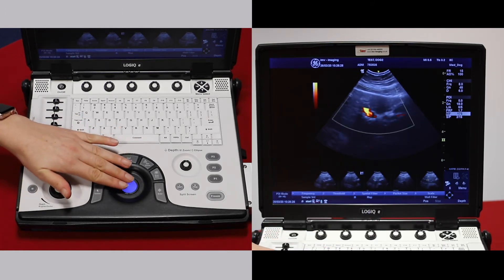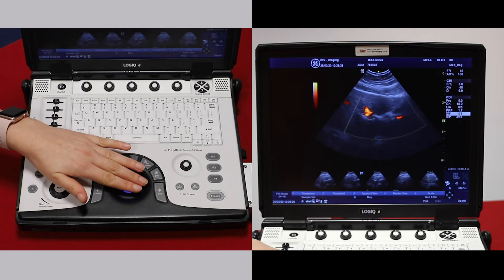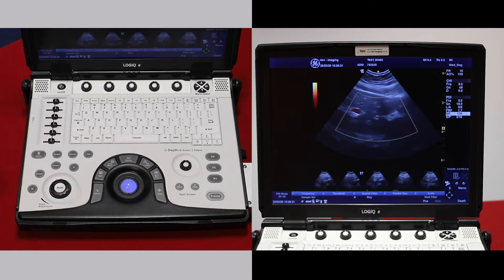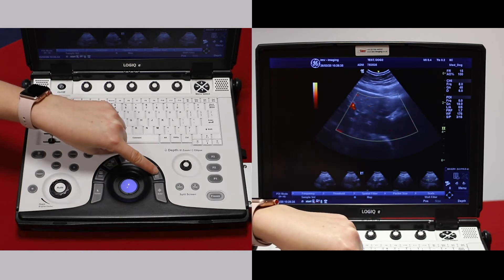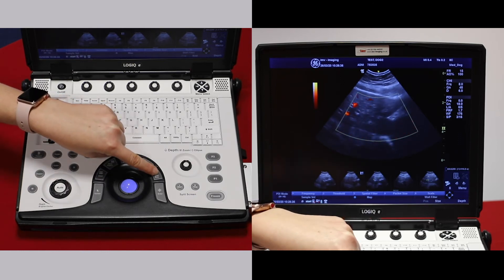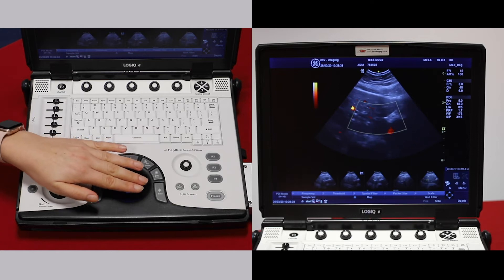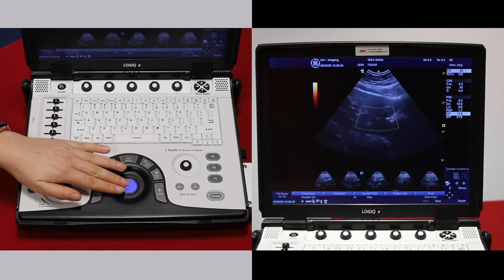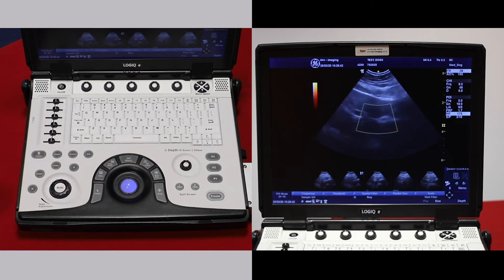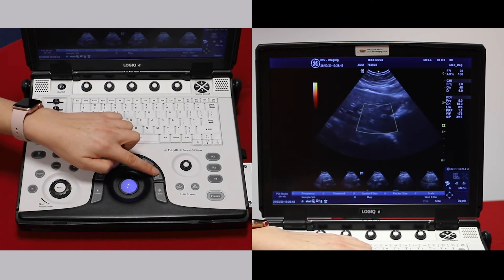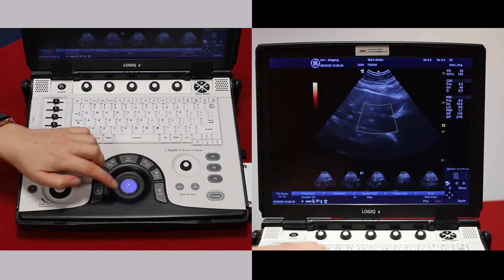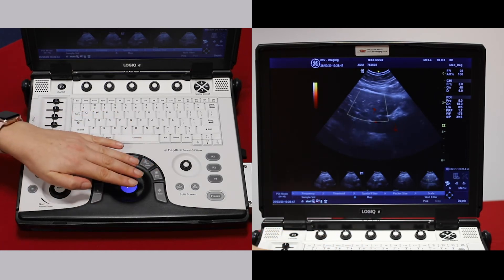To move your region of interest box around, move the trackball. To change the size of your region of interest box, press scan area to the right of the trackball. Now move the trackball and it will change the size of your region of interest box. Press scan area again to be able to move around.